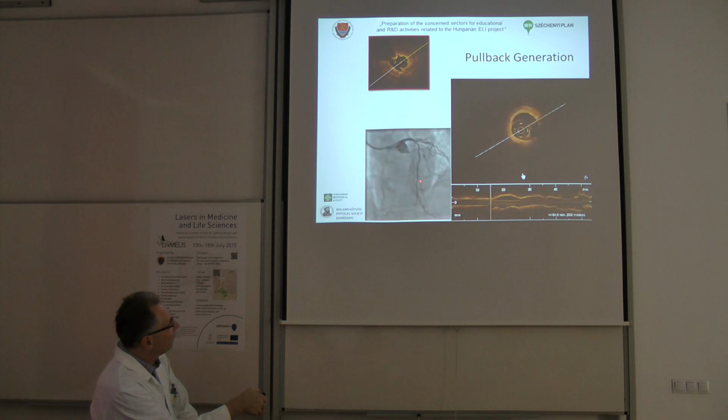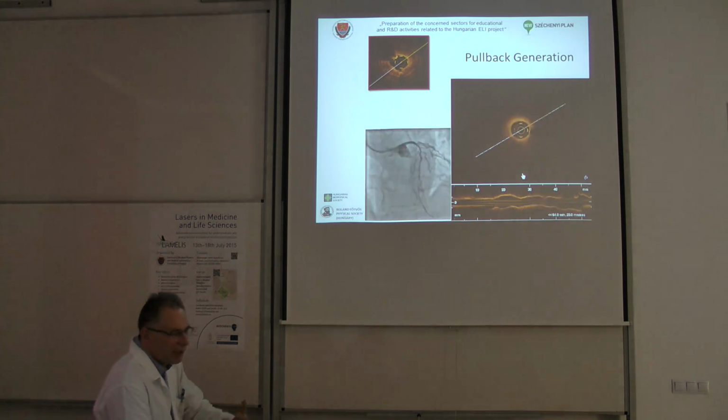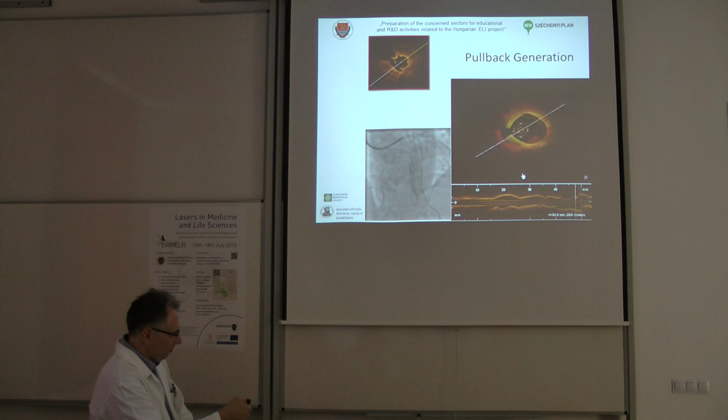So the optical lens, you cannot identify on this image because it's really not extra marked.